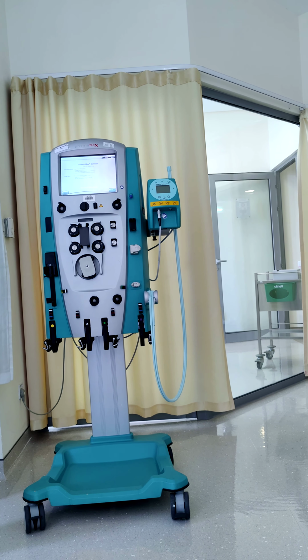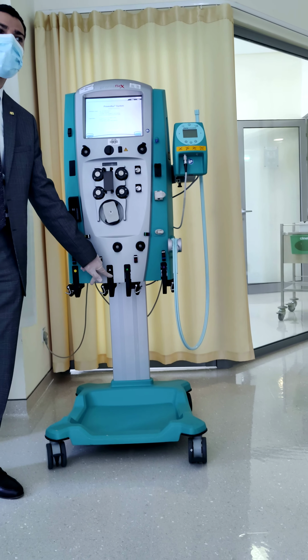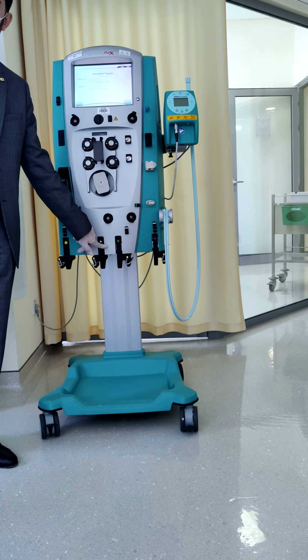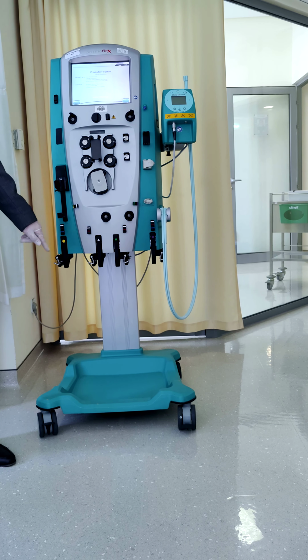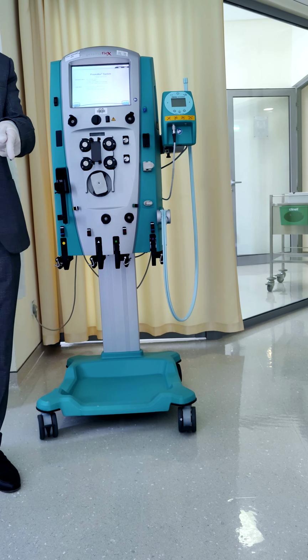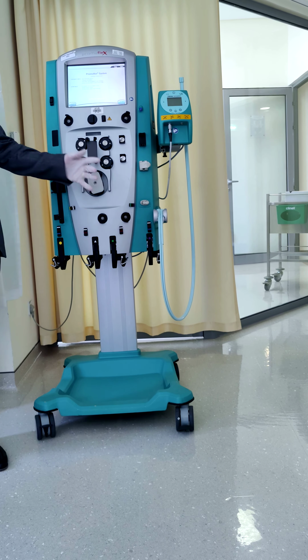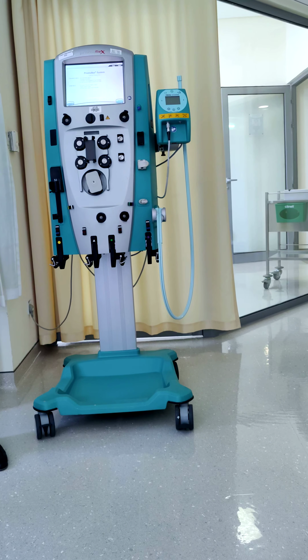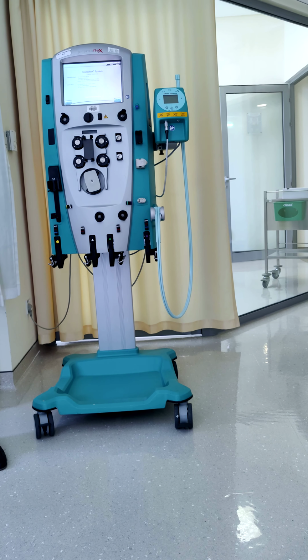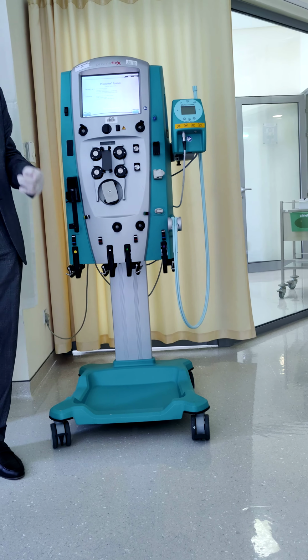This is the difference between the CRRT and TPE. Any pre-blood pump solution you will add, any dose you will use, it will not return back to the machine from the patient. You are adding it to the patient's body weight. If you are using 100 ml per hour for 3 hours, it means the patient will gain 300 ml in 3 hours. And the machine will not take it again. This is very important.